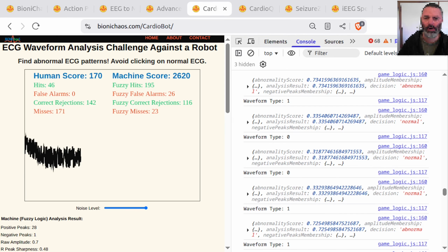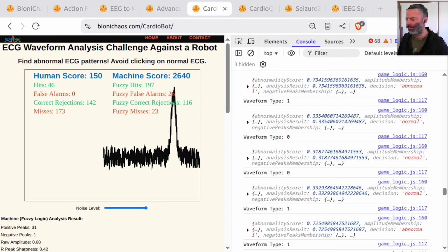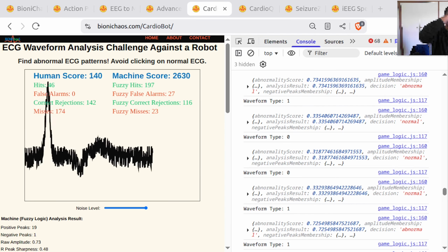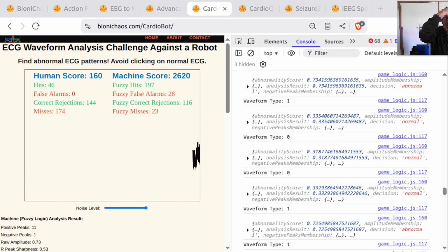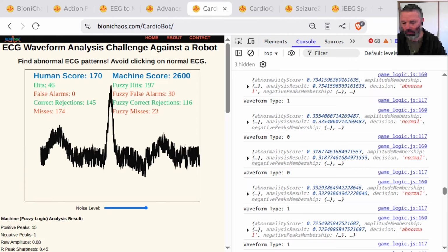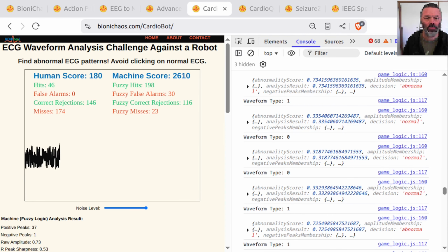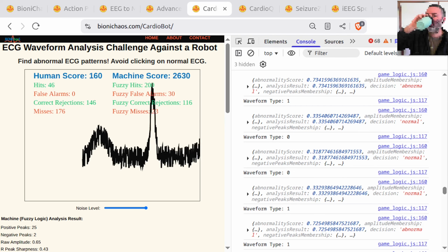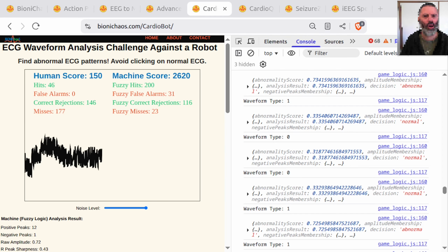So the Python backend gives you a pre-built turbocharged engine for detecting the peaks and counting the spikes. In JavaScript, you'd be building that engine from scratch, and it might sputter. Got it. Challenge 2. The fuzzy logic inference. This is the bigger problem. The fuzzanalysis.py uses the skfuzzy library. This library is not just a math function, it's a complete fuzzy control system. The judge we talked about. The logic that decides how likely an abnormality is?